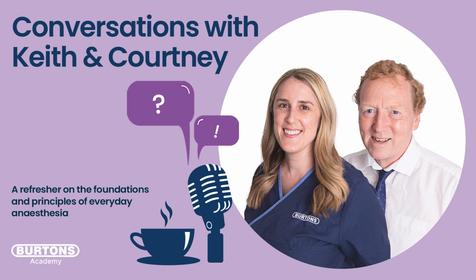If you have a human monitor or a monitor that's got a very high side stream sampling rate of, say, 200 mils per minute, you're sucking off 3 mils per second. That's a significant amount, again, in an animal that breathes out in 1 second and then breathes out 4 mils or 5 mils. You're taking a huge amount out, and there will inevitably be a dilution of that. So you'll start to see molehills again.